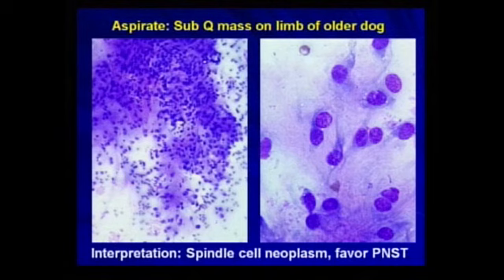We would call them all cutaneous spindle cell sarcoma because essentially they're all low-grade malignancies which are very invasive, difficult to excise completely, and tend to increase in grade with repeated attempts at surgical excision. And then for a period of time, over the last 10 or 15 years, there were a lot of papers which were splitting these out, the hemangiopericytomas from the peripheral nerve sheath tumors.